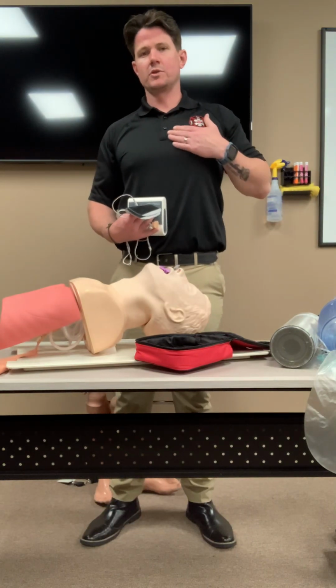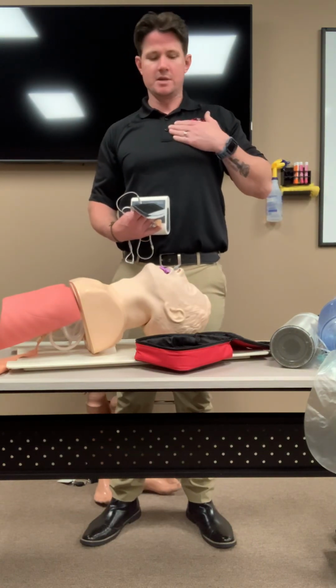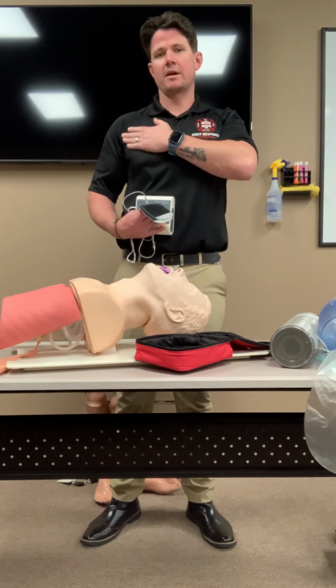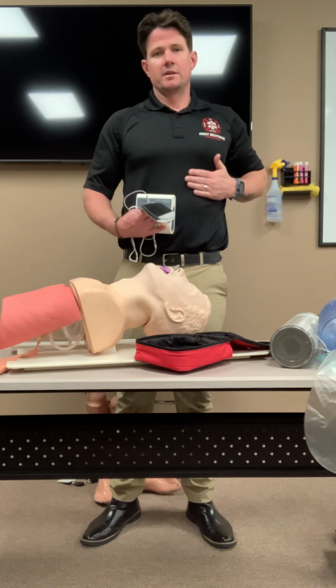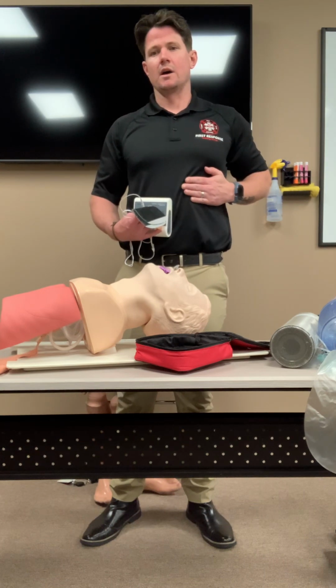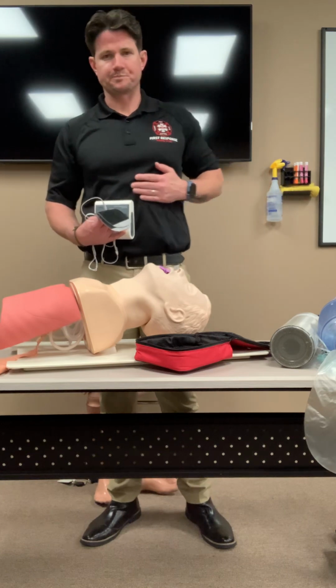Now, when you're looking at this, it's going to look like your left, but this is my right. All right, it's going to look like my left, but this is my right, okay? And then the other pad goes down just below my chest on my left side, okay?